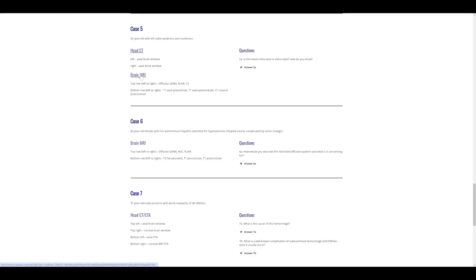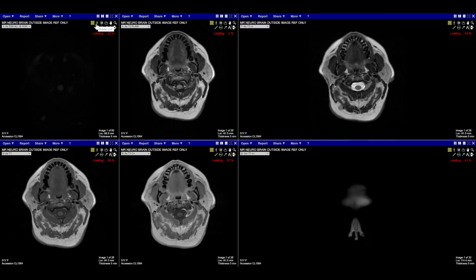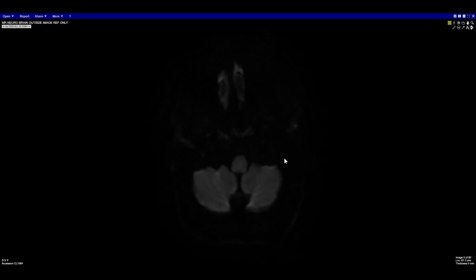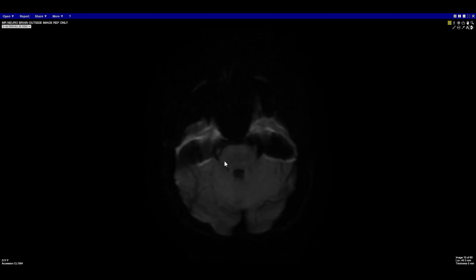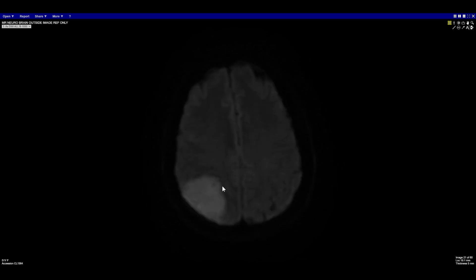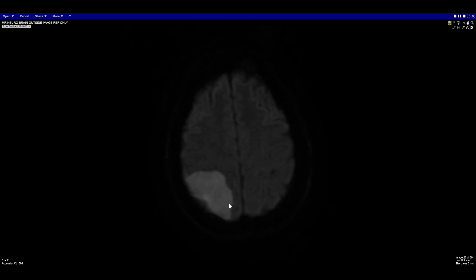Now we've gone back to our case window and we're looking at the brain MRI. We have diffusion, FLAIR, T2, and pre- and post-contrast, plus a coronal post-contrast. Starting with diffusion — you know it's diffusion because the background has relatively low signal. Not a lot going on in the brain parenchyma. Again, the ventricle is a little smaller on the right side. But near the vertex, we've got a pretty hyperintense diffusion mass along the right parietal convexity, with a broad dural attachment.